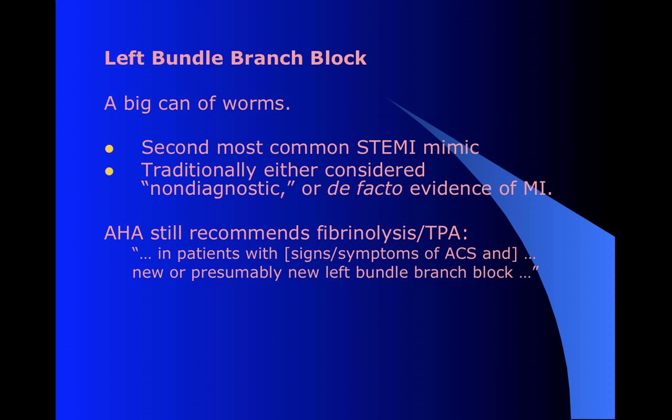Now, the reason you would call it non-diagnostic is because it's tricky to recognize an MI when there's left bundle branch block. So that's fair. We don't want to say that we're not going to try and help these people, because you can get a left bundle branch block which is caused by a heart attack. So the AHA has gone the other direction. They say if you see a left bundle branch block, which as far as we know is new, meaning the patient didn't have it a year ago and it was diagnosed, but it seems to be new, we're going to assume that there is an MI there.